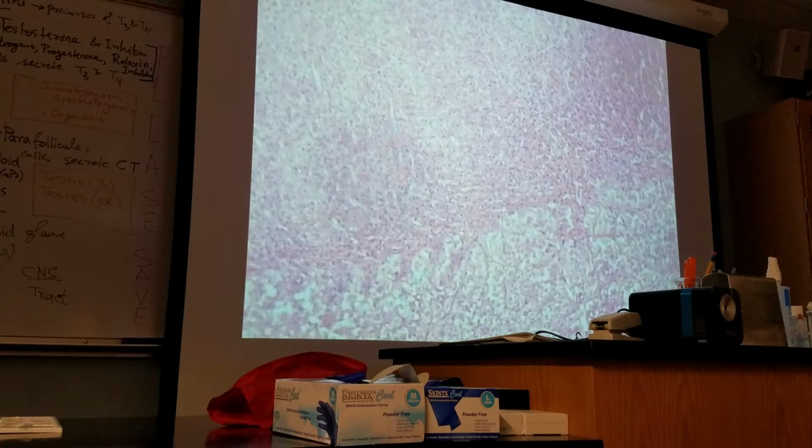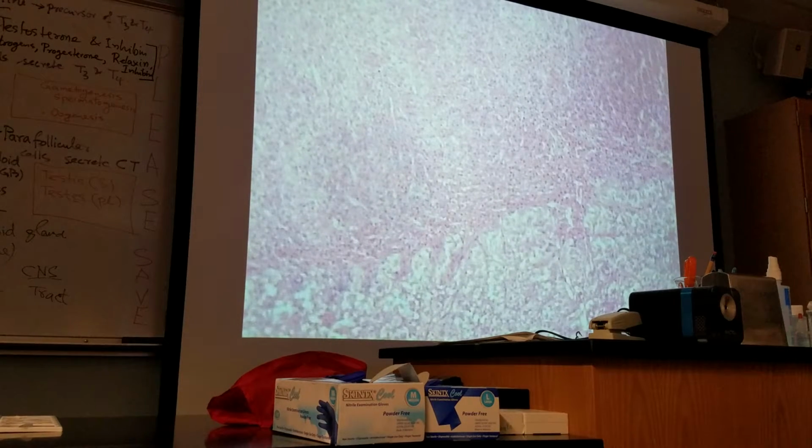So this is adrenal cortex, though this is the zona reticularis. Don't write zona reticularis. If you are very tempted to write it, first write adrenal cortex, then within parentheses you can write zona reticularis. Okay?